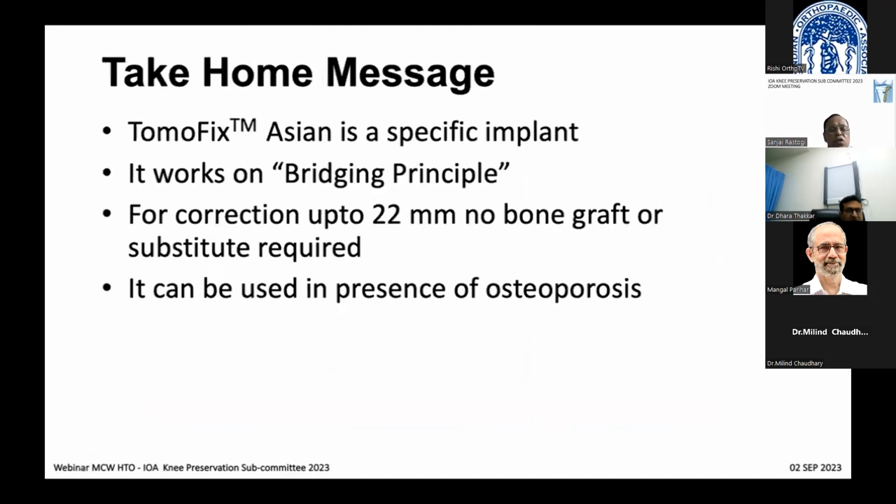So the take-home message so far as the Tomofix is concerned: this newer version is Asian specific. It works on the bridging principle. A correction of up to 22 millimeters is possible. No graft is required, and it can be used even in the presence of osteoporosis.